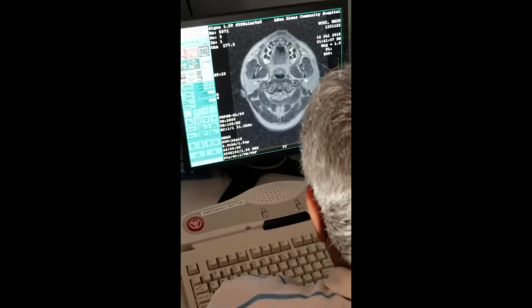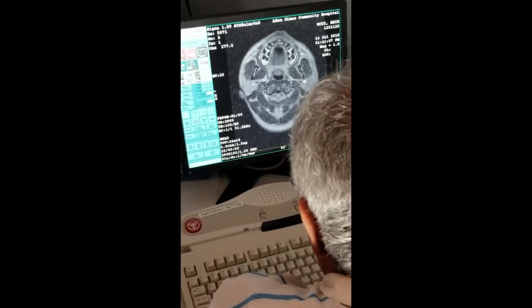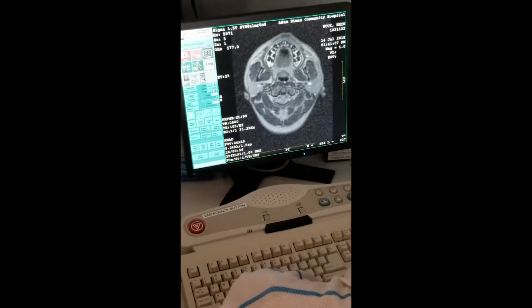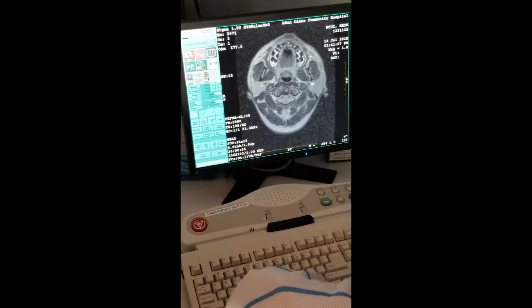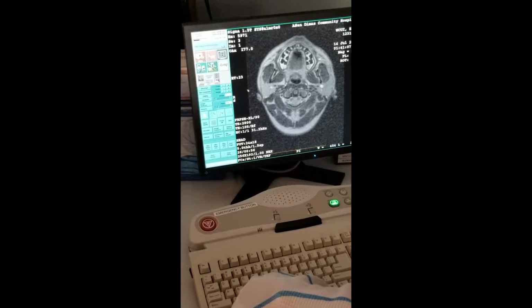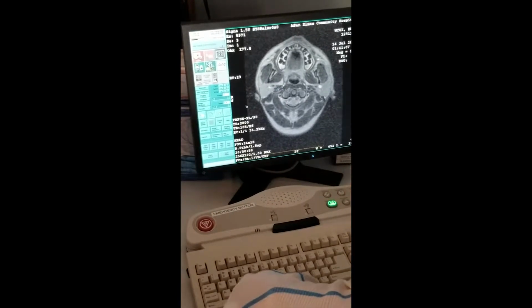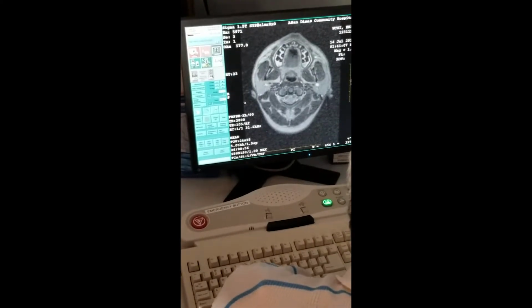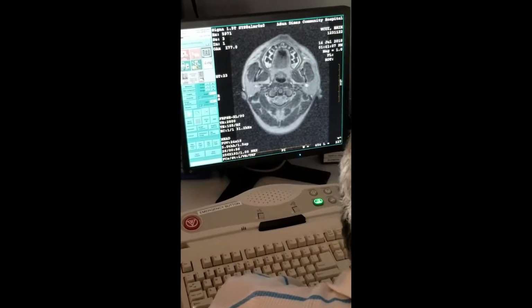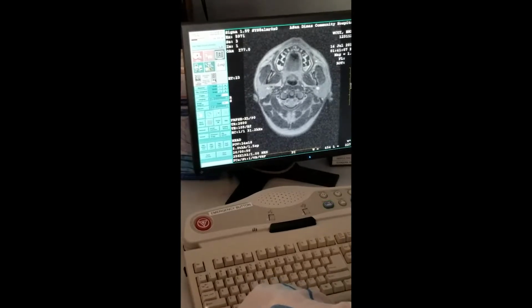What you're saying is on sagittal, you say start collecting here. That's 1 TR, right? But here I said no. Is there any tissue here? Is there any tissue here? What are you collecting? Air. Noise, air. So why bother? Start collecting when you get close to the tissue. So then start collecting here. That's what this is.